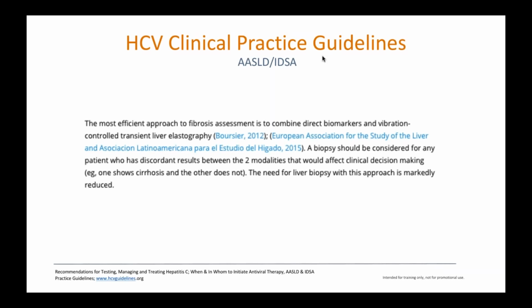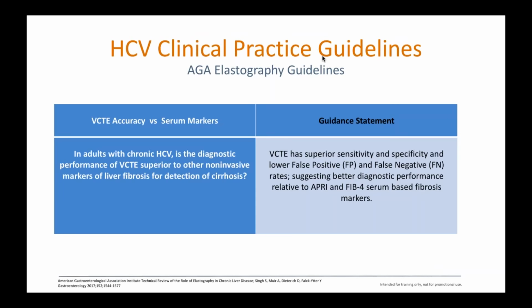However, in that guidance document, they didn't provide any specifics on how to combine them and what threshold values might be useful and what would be the accuracy of those thresholds. So I'm going to expand on what they said and bring in the AGA elastography guidelines.